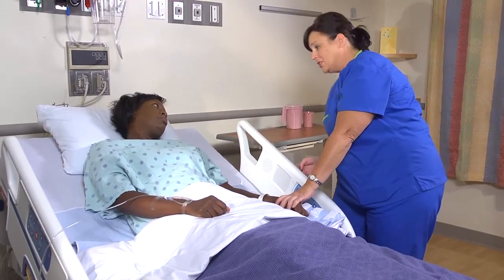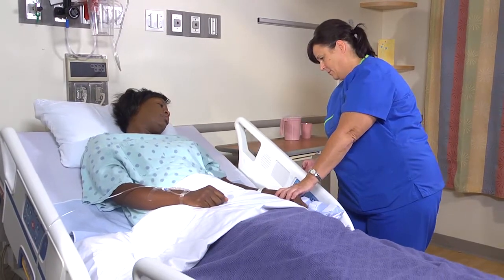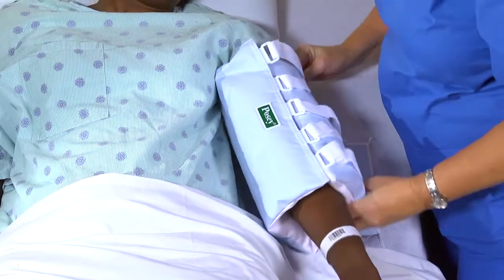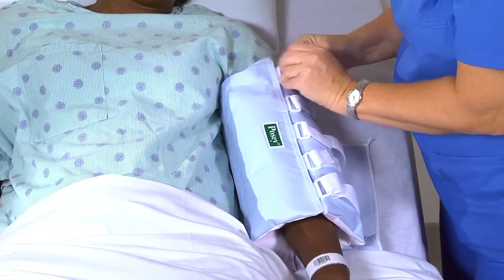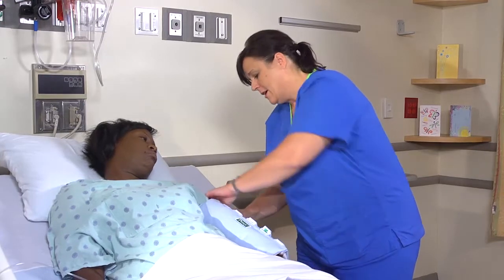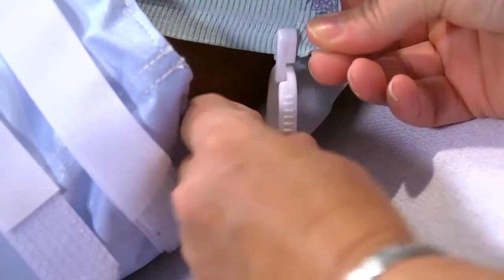Explain to the patient that you are going to apply the elbow device to help her stop picking at her IV line. Place the restraint around your patient's arm so that the elbow joint rests against the padded area. Keeping the elbow rigid, secure the splint with the Velcro straps. Check the fit of the restraint. Then hook the clip at the upper end of the sleeve of the patient's gown.